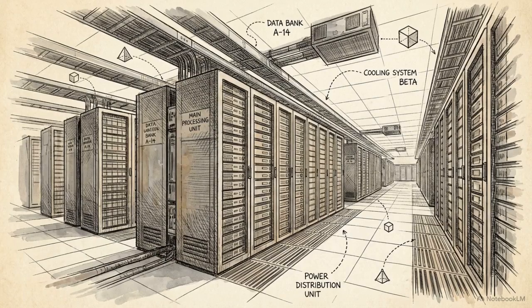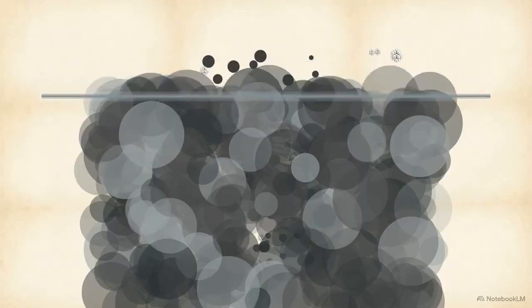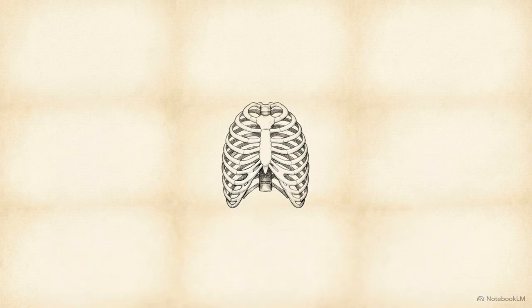Training this network requires extensive volumetric data. The researchers utilized the RibFrac dataset, which provides high-resolution thoracic CT scans with explicitly annotated bone structures. The algorithm first applies value-based thresholding and morphological operations to the raw scans. This strips away noise and soft tissue, isolating clean, contiguous bony segments.